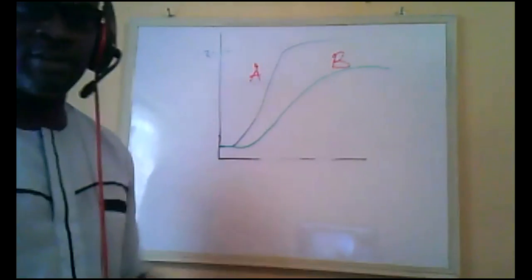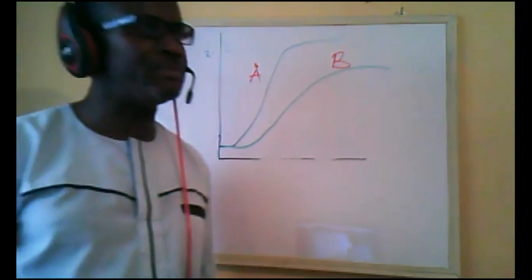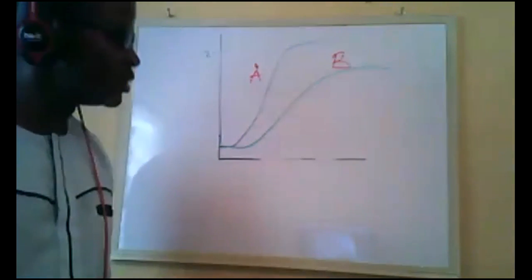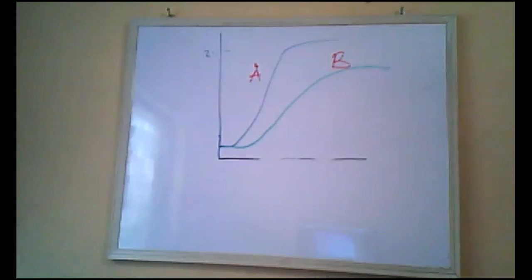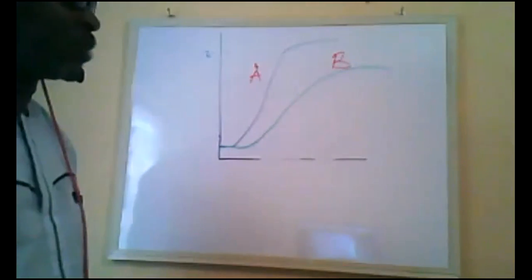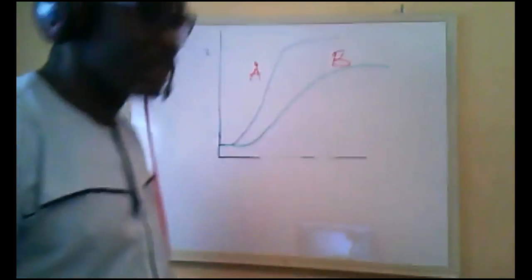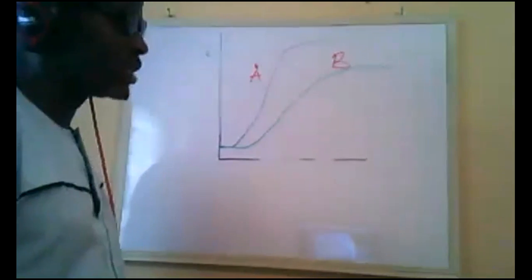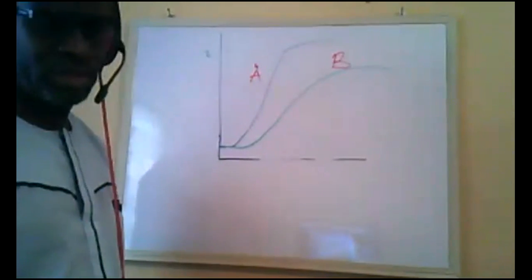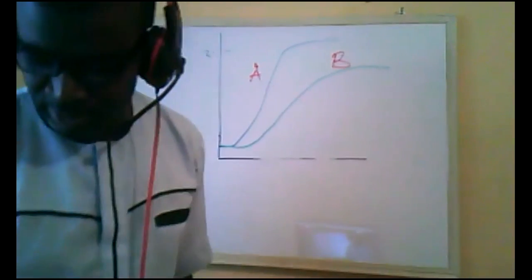So these are many of the things that should be done when a new film pack has been bought. Check all these things to see if the film pack passes all these requirements of quality control. So this is one of them. And another thing, let's see.